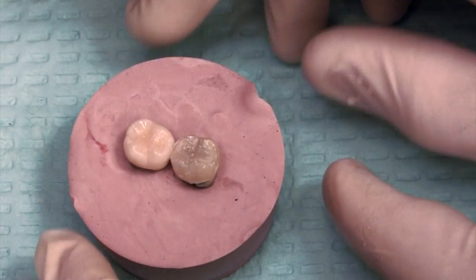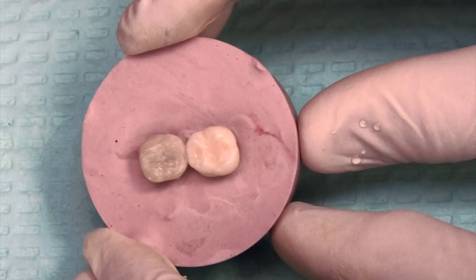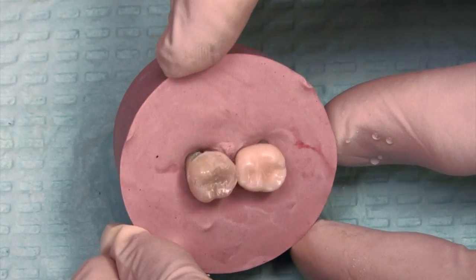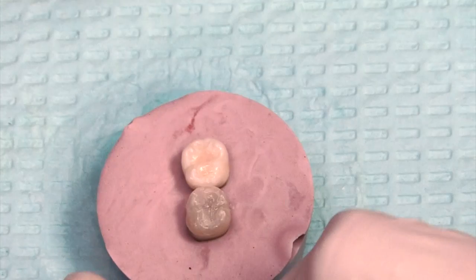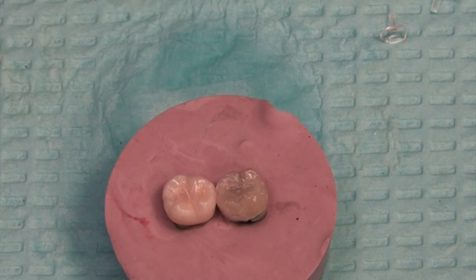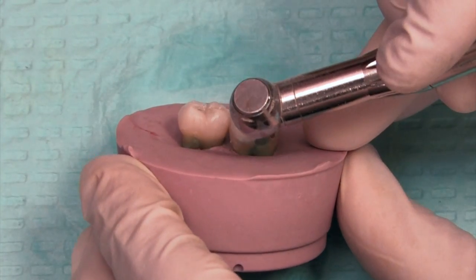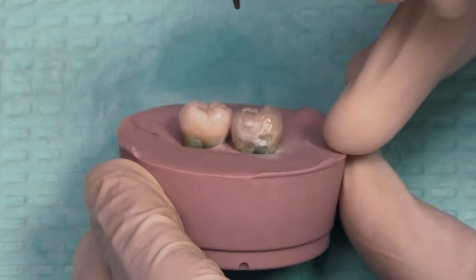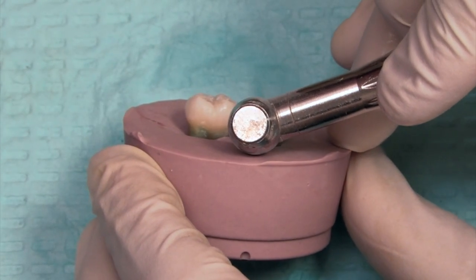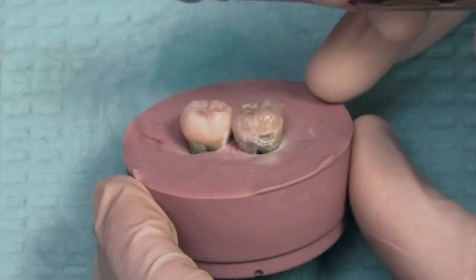That pretty much wraps it up for the interproximal filling. Obviously we can't check occlusion at this point, but that shows the basic steps in how we place a filling. Next we're going to prepare the class 5. This tooth already had a notch in it. This stone block is blocking my drill head from going into the exact position I want, but I just want to open up this prep and show the steps we go through in placing a class 5 filling.